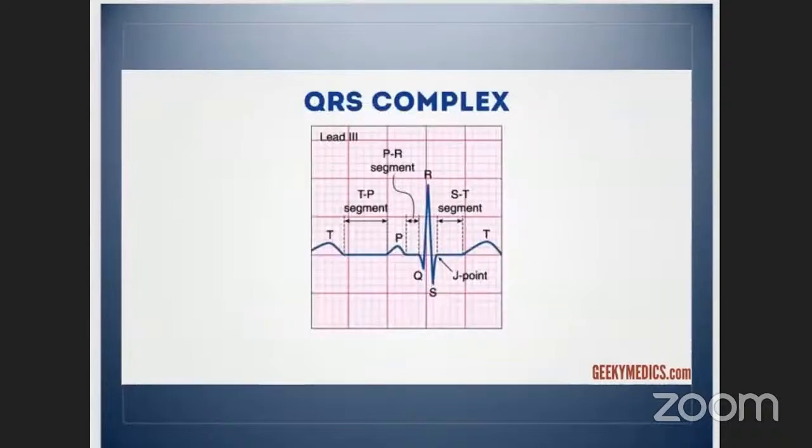Okay, looking at our QRS complex. So we know this to be the TP segment. So this is the electrically neutral line that we use to assess our J point changes, as opposed to the PR segment. I'll elaborate on that a bit later. And so we have our P wave, we have our PR segment, and going into our QRS complex.